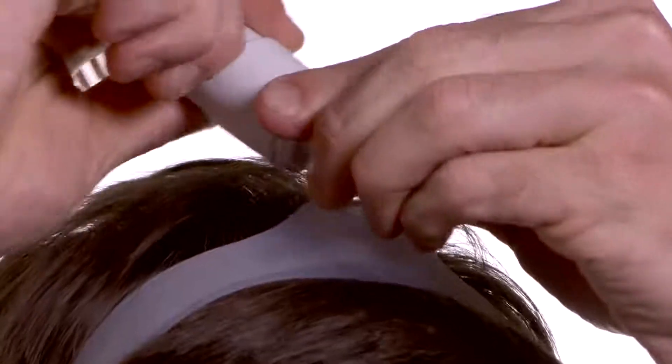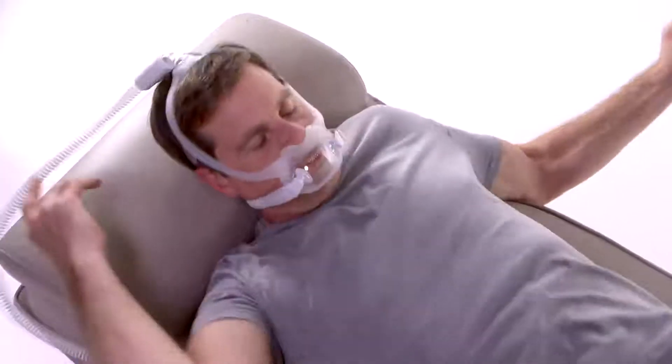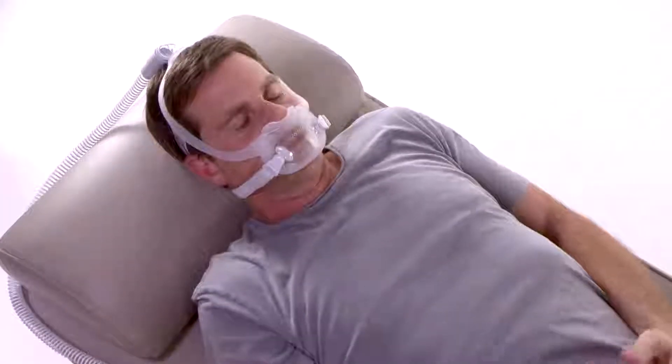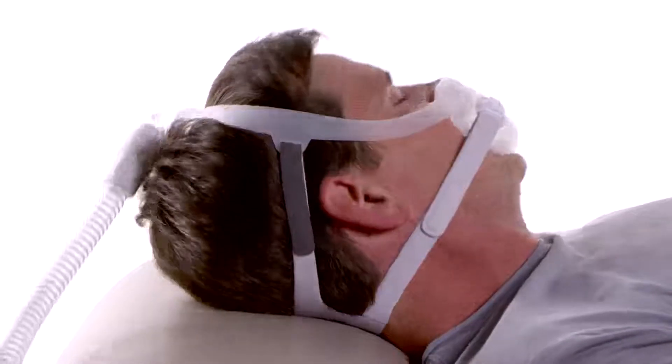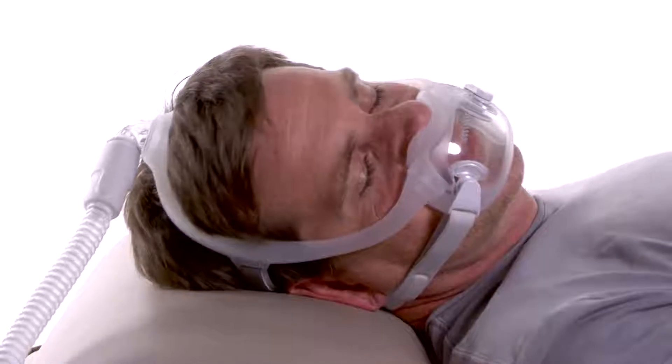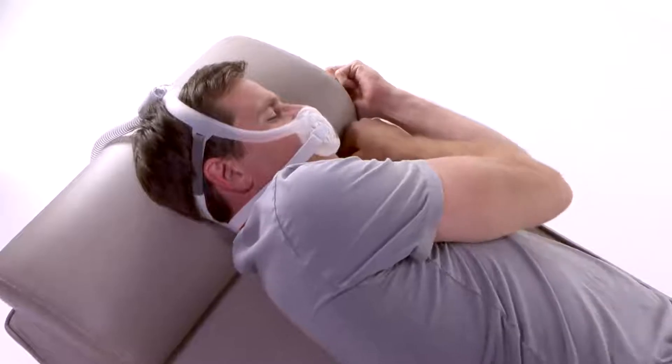Once the mask is in position, connect the quick release with the attached tubing to the elbow. Lie down for final adjustments and turn the CPAP device on. Breathe normally through your nose and turn your head from side to side. Assume different positions in order to identify any leaks that may interfere with sleep.